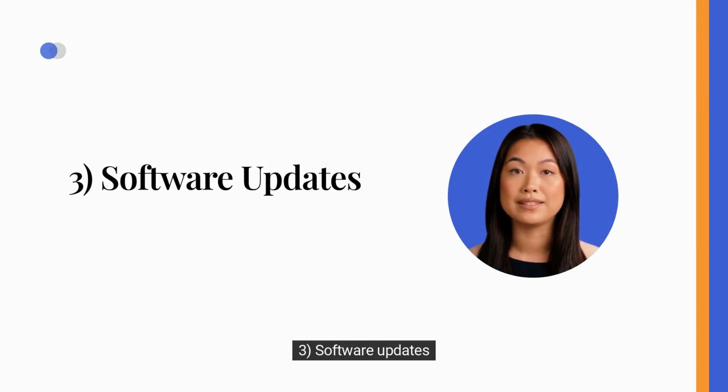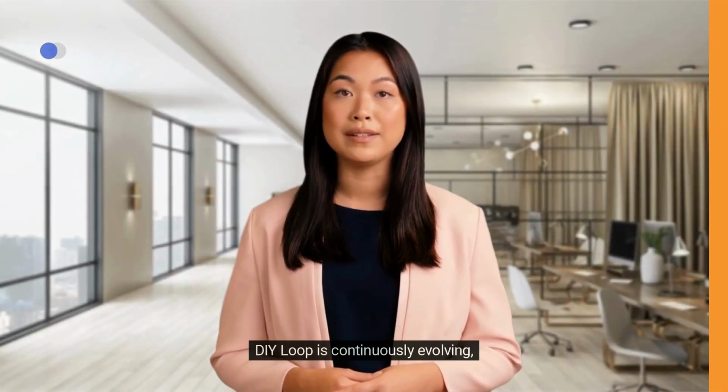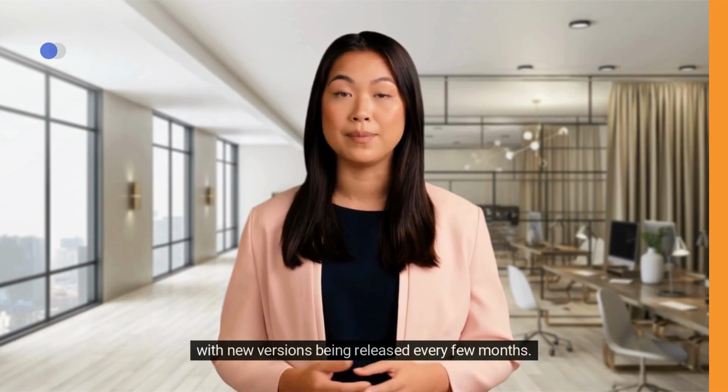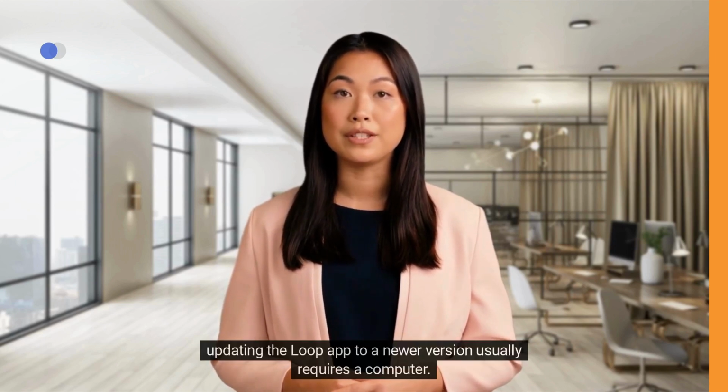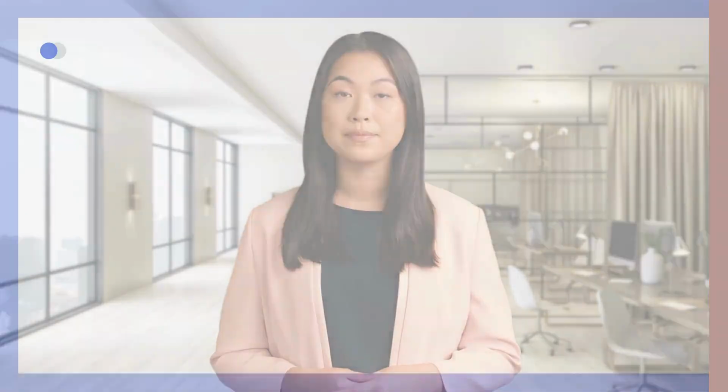3. Software updates. DIY Loop is continuously evolving, with new versions being released every few months. These updates bring improvements, bug fixes, and new features to enhance the user experience. However, updating the Loop app to a newer version usually requires a computer.